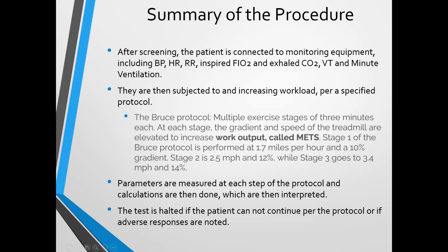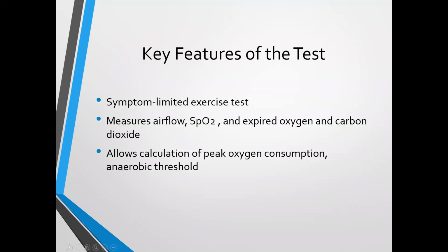And really, most of the procedures for cardiopulmonary exercise stress testing involve having a physician in very close proximity should the patient need some emergency treatment. Should they need, whether it be BLS or ACLS and any medications, things along those lines, the response could be done very, very quickly, understanding we're putting an exercise load on an individual.